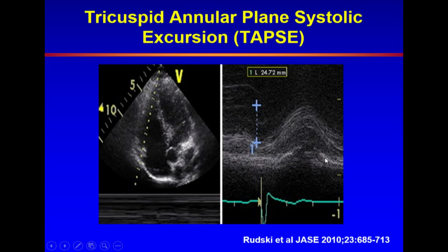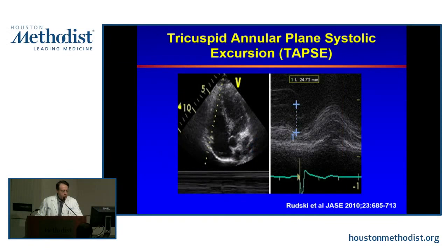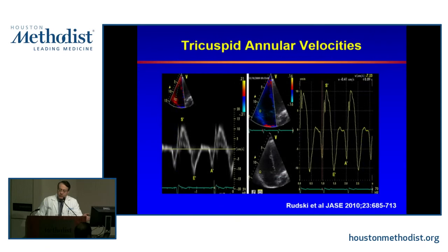The cutoff in the 2015 guidelines is 17 millimeter. Less than that is not good. More than that, you are willing to pass. I mean, the way I would look at using all of these indices, at the end, you are looking at the indices and using your own judgment and conclusions.